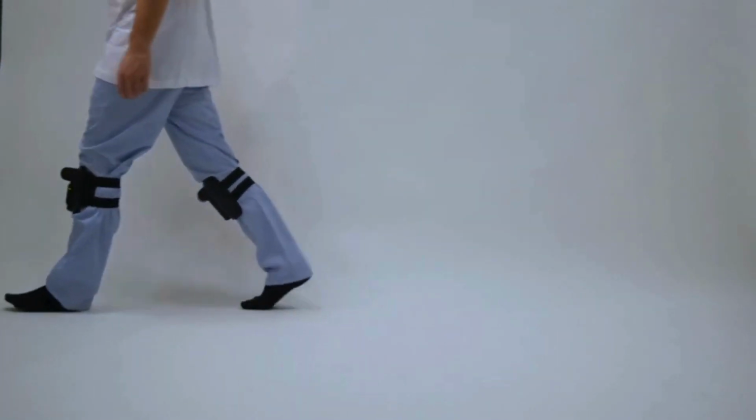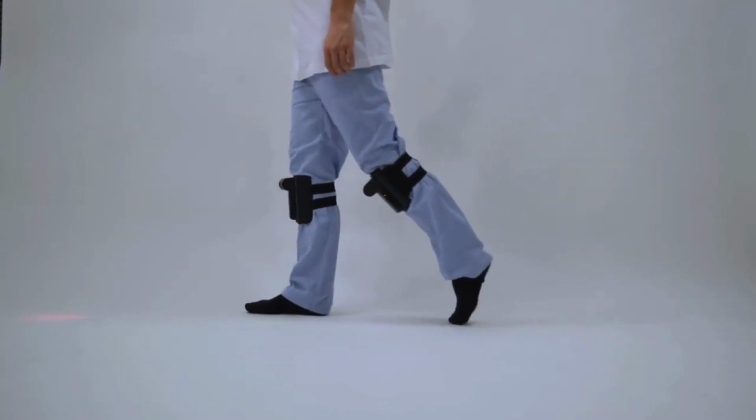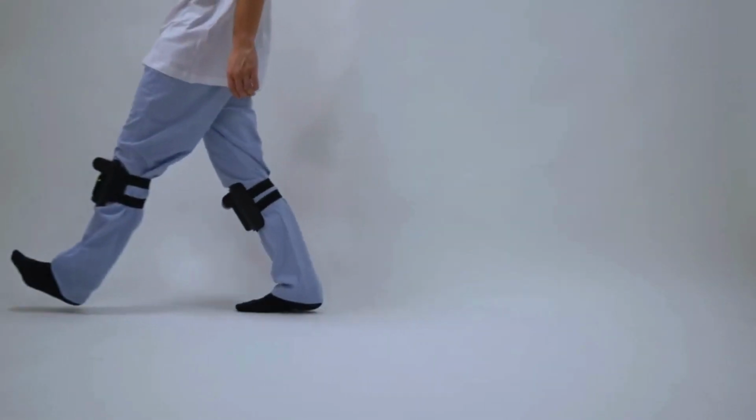Walking with long strides. In this exercise, the patient is asked to walk while lengthening his stride a lot. Visual feedback helps to indicate the target to be reached and to maintain the length set by the physiotherapist.